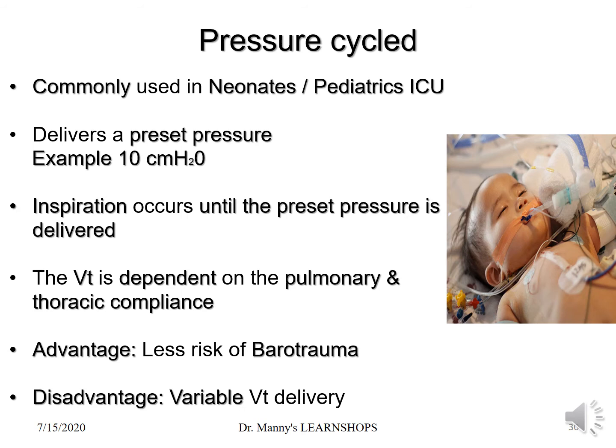So therefore the advantage of pressure cycled ventilators and ventilation is there's less risk of pressure trauma because you're controlling the pressure. However, the disadvantage is you're not going to be sure of what the actual tidal volume is that is actually being delivered to the patient, because this is dependent on the airway resistance, the pulmonary compliance, the thoracic compliance.